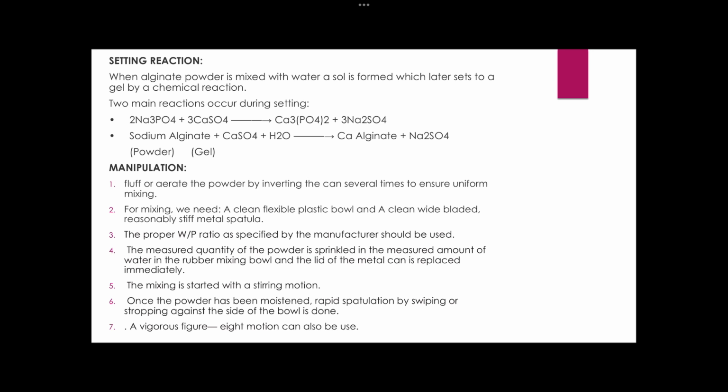The mixing is started with a stirring motion. Once the powder has been moistened, rapid spatulation by sweeping or stropping against the sides of the bowl is done. It means you are supposed to mix against the walls of the bowl, with a vigorous figure-of-eight motion. Okay.